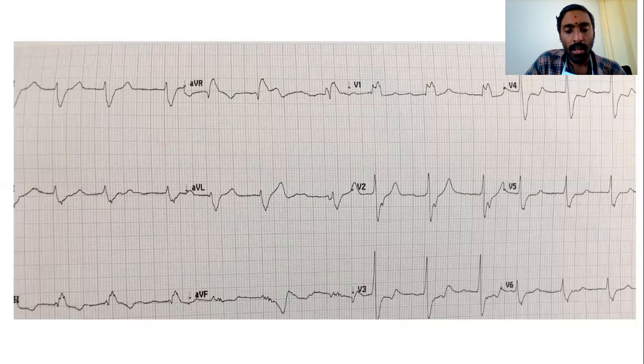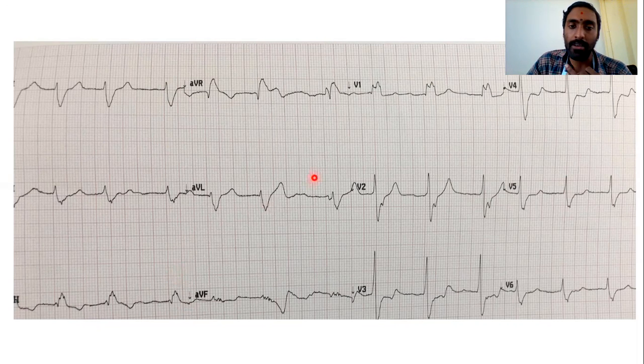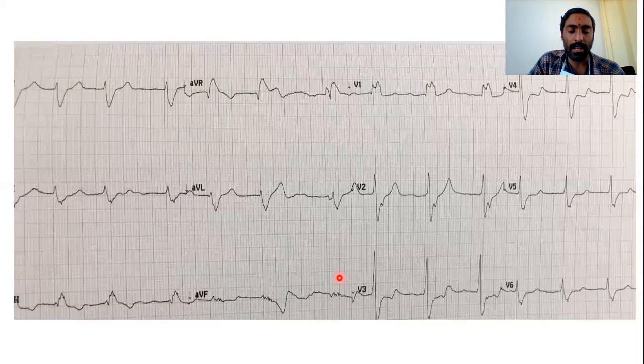Coming here, assuming the standardization is normal, the rhythm is irregular, and we don't see clear-cut P waves. The rhythm is very irregular. The intervals cannot be clearly defined here. Then we look at the axis. Lead 1 is negative, lead AVF is negative.